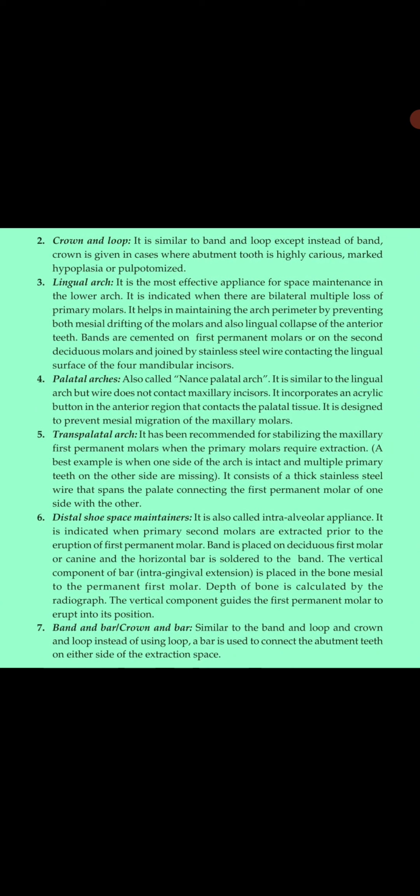Now come to the palatal arch, and this is only used in the palate, also known as Nance palatal arch. It is similar to the lingual arch, but the wire does not contact the maxillary incisors. In lingual arch, the wire contacts the four anterior mandibular incisors, but in palatal arch, it does not contact the maxillary incisors.